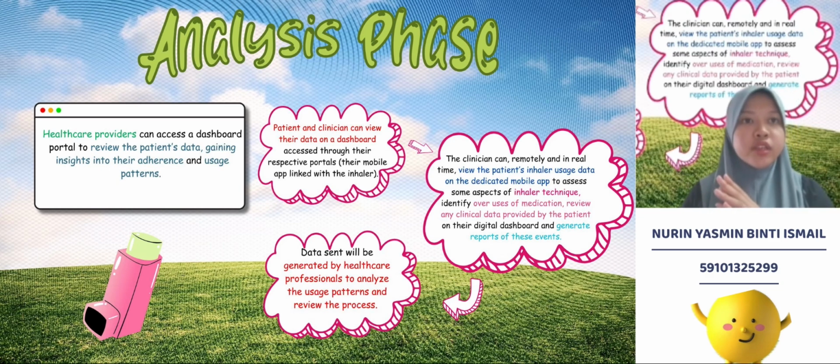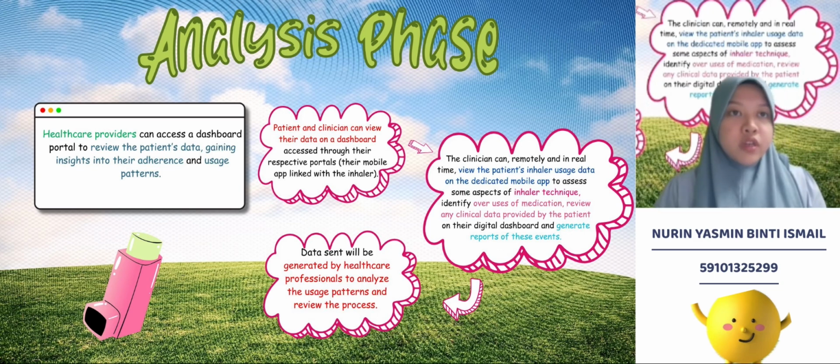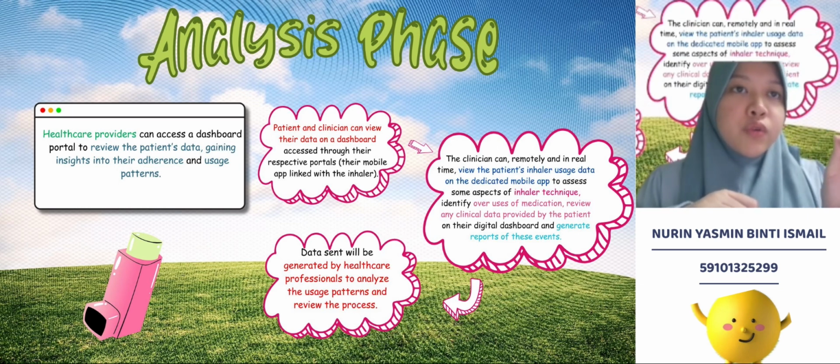Other than that, the clinician can also review any clinical data provided by the patients through their dashboards. They can also generate reports of these events. Moreover, the clinician can identify overuse of the medication. Last but not least, data will be sent and generated by the professional to analyze the usage patterns and review the process.